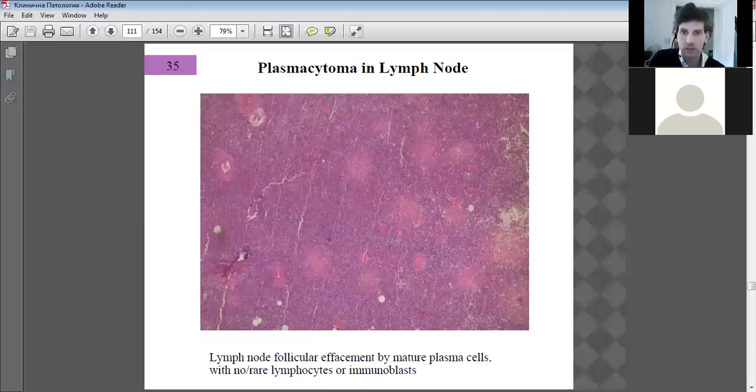Little one there. Okay. Mature plasma cells. Looking for a nucleus, stained nucleus, probably there. There's a mature plasma cell there. I don't see a lot of them. You need probably another differential stain to pick them up, but there's one example there.